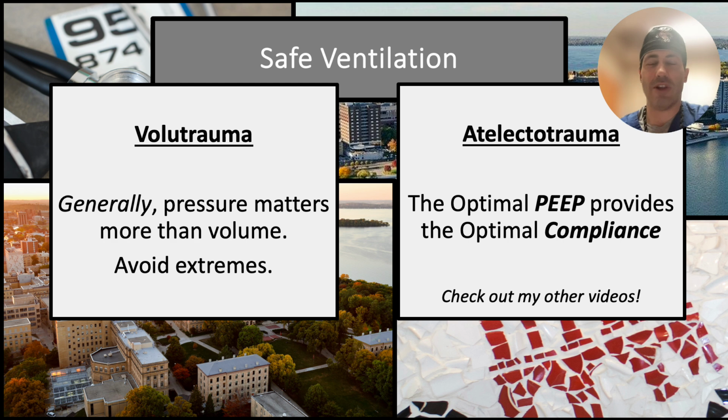I've really focused a lot on safe ventilation for driving pressure, and that's the key thing to hurting someone on a ventilator, is how much pressure you deliver above PEEP, how much energy or how much you have to hit the lung to get the volume you want. But of course, volume trauma matters. Avoid very large tidal volumes.